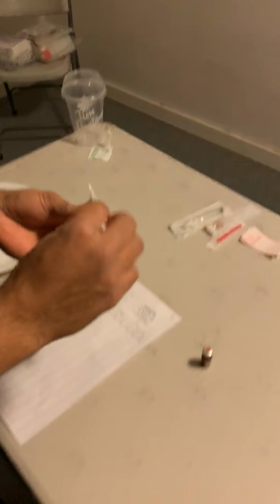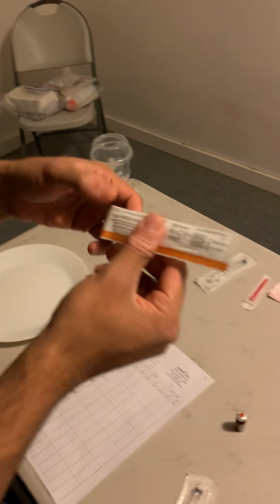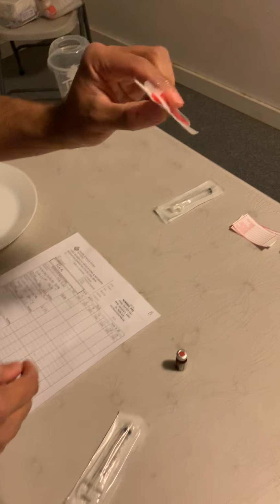I'm going to be needing a 3 ml syringe, since I'm drawing up 1 ml. I'm going to be needing a 25 gauge 5/8 inch needle, which is the appropriate size for a subcutaneous injection. And I'm going to be needing a blunt fill.